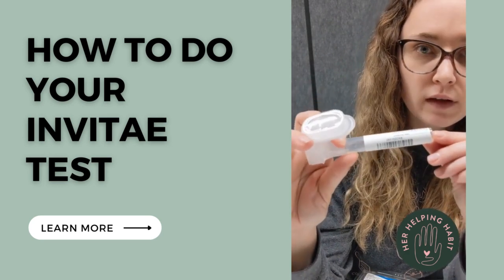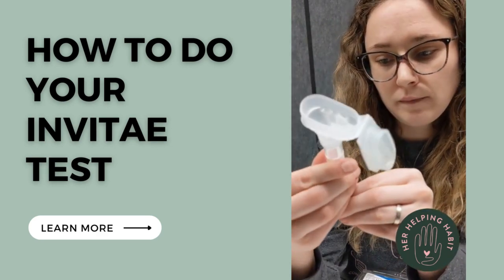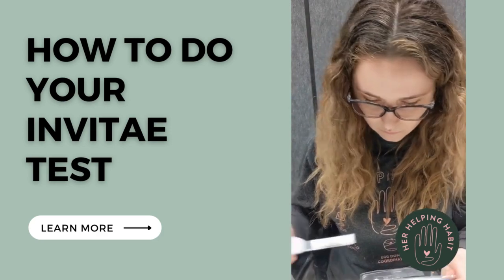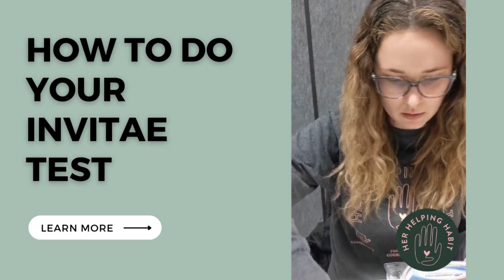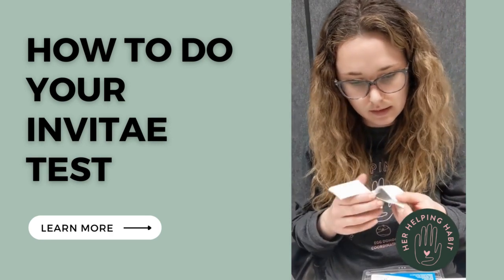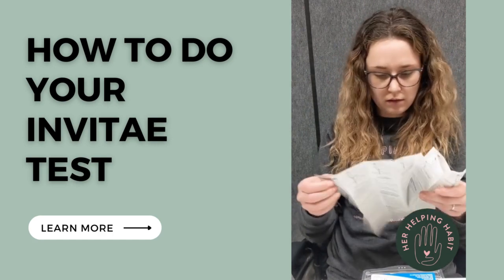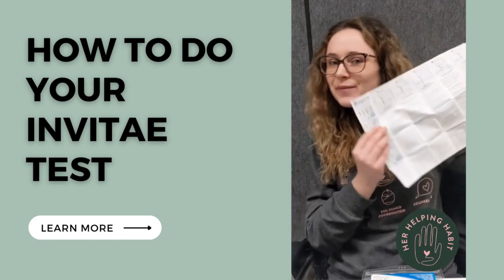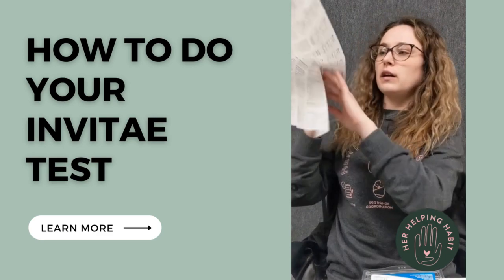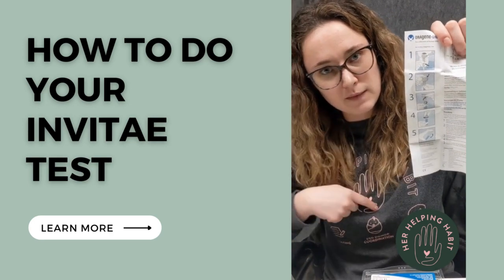I'll fill in today's date because this is the day we're collecting the sample. Once that's all done, just put it to the side on your specimen bag so it doesn't get dirty. There's another little instruction booklet in here specifically about the spitting process. It has several different languages if you need, but really the five-step process is all you need.